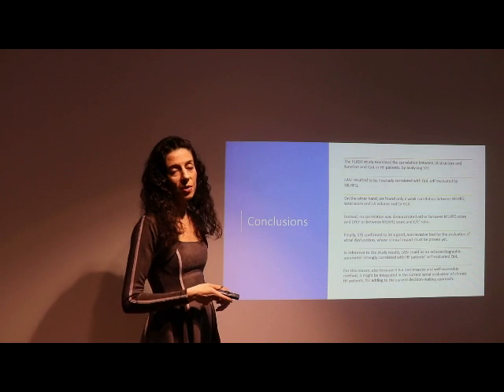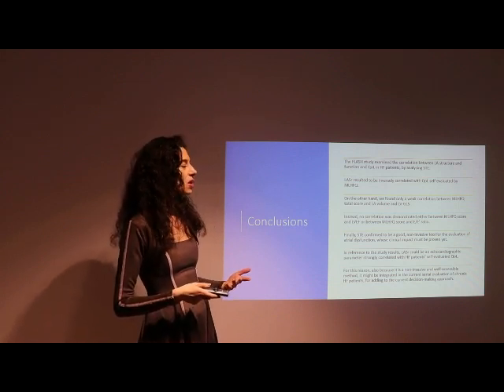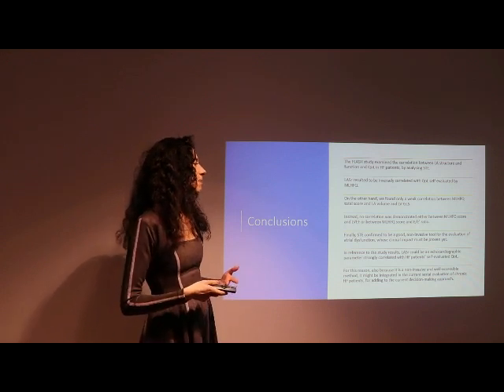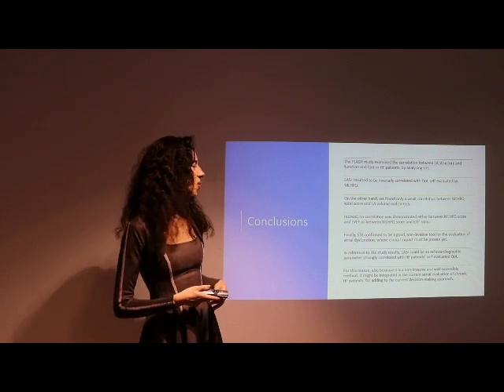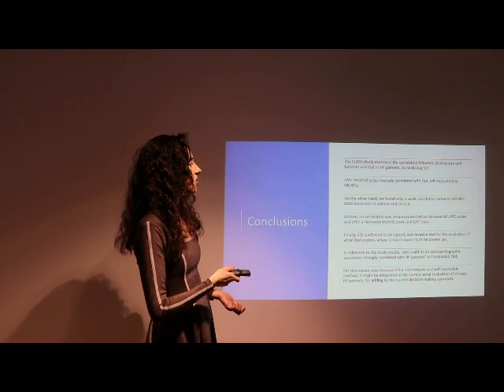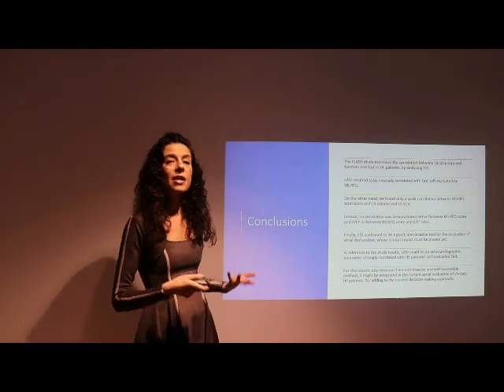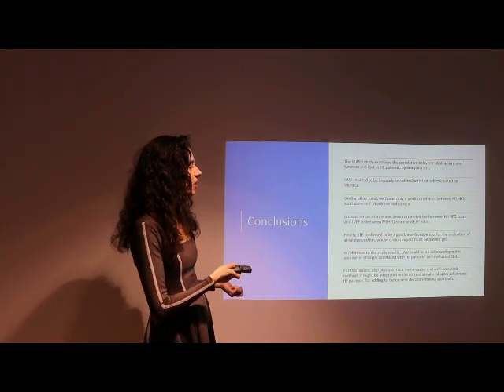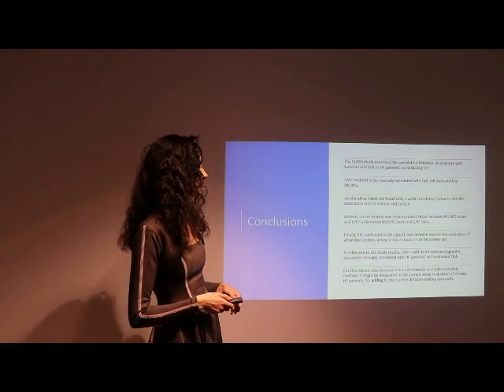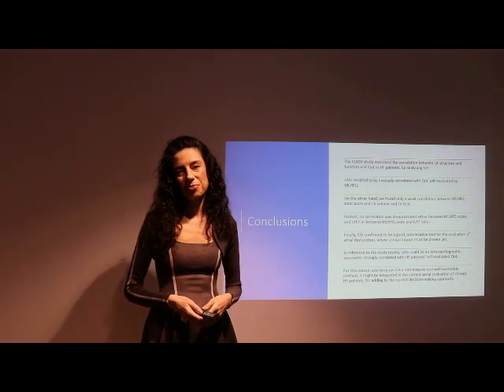In reference to our study results, left atrial strain could be an echocardiographic parameter strongly correlated with heart failure patients' self-evaluated quality of life, and for this reason, and also because it is a non-invasive and well-accessible method, it might be integrated in the current serial evaluation of chronic heart failure patients, this way adding to the current decision-making process.